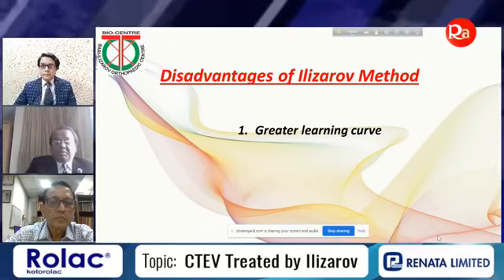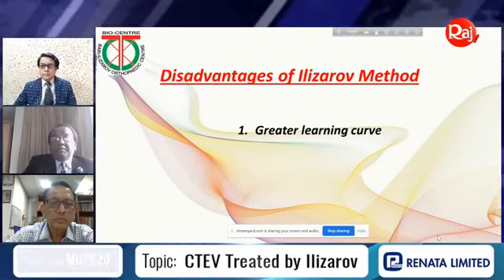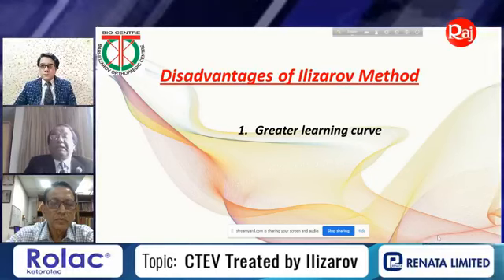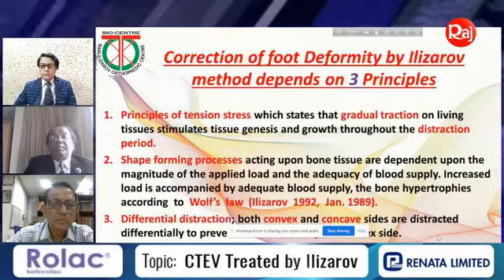Limitless, infinite. If you do Ilizarov, you will not be able to understand every day what you are doing, and it will give you learning. That's why Ilizarov always has a steep or greater learning curve.